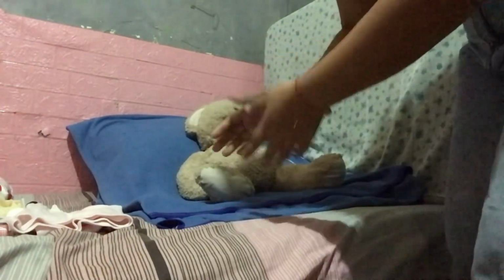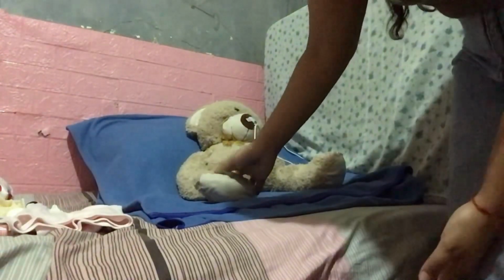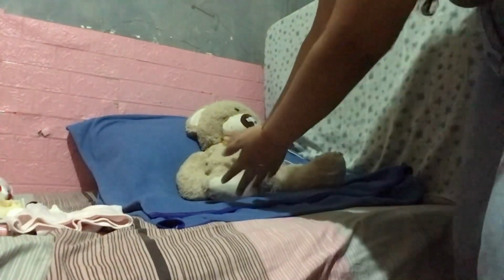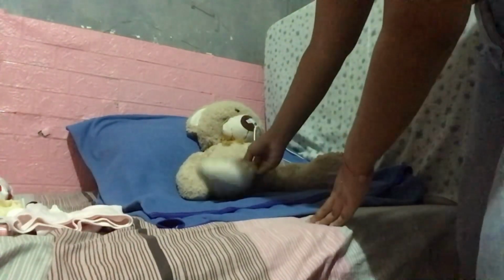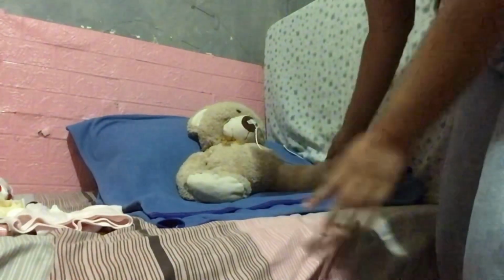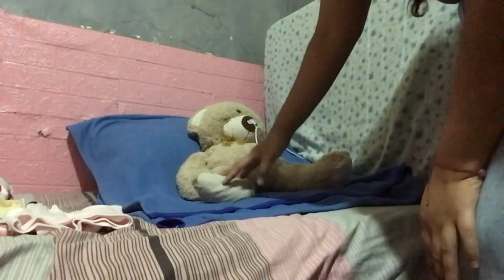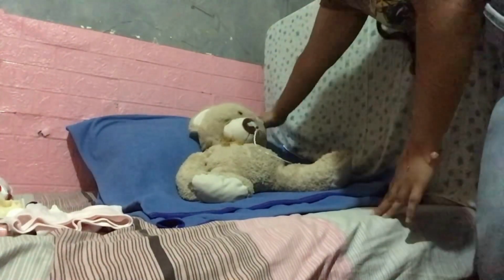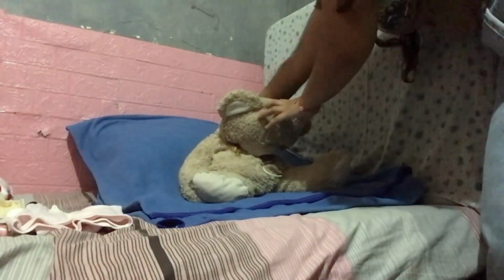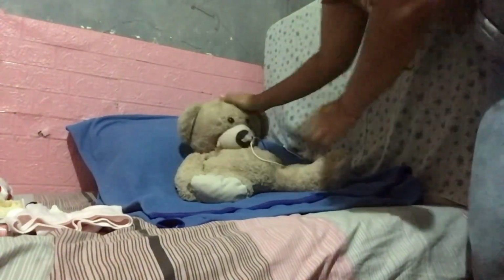then you have to now position the client. So ensure the patient is lying comfortably on their back with knees slightly bent. So just imagine the knees of the patient is slightly bent and of course apart. And then alternately they can stand with their feet apart and lean against a stable surface. So make sure that the patient is comfortable to that position. So this is the surface for the support.